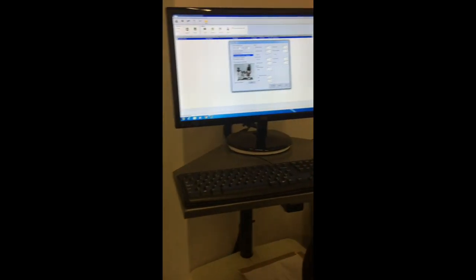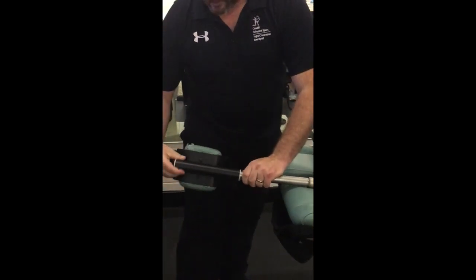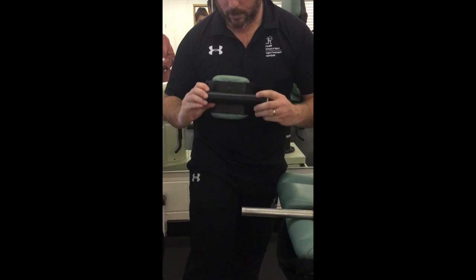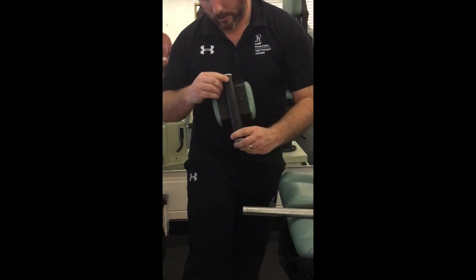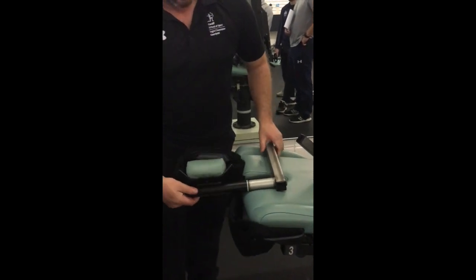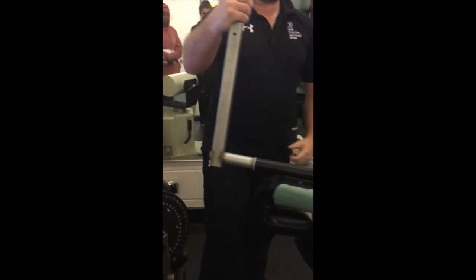What I don't mind too much is if you happen to leave that on this one. But it's all like a pair of crutches. There should be a hole somewhere on there that'll just mean it'll click in. Like so. So you can now see that that's going to do a knee.